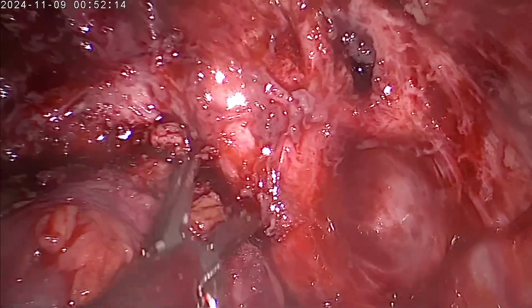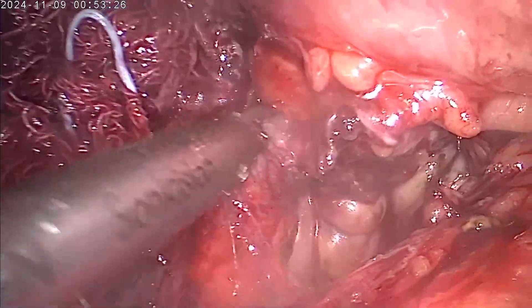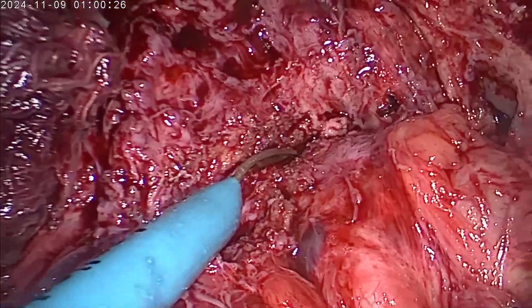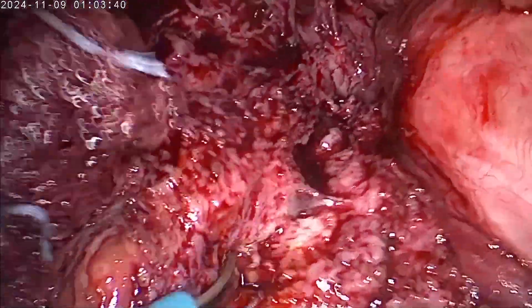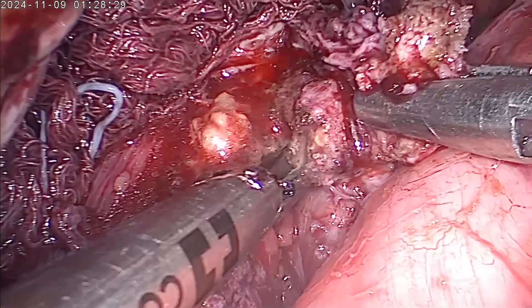We bisect the nodule, leaving one portion on the uterine torus and the other end on the bowel. We use both cold scissors and the harmonic for performing this step. Next, we remove the nodule from the uterine end on the left side.